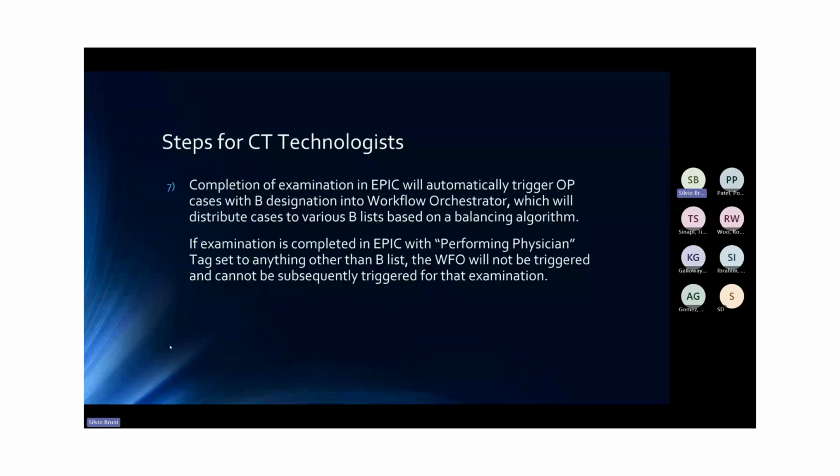Notably, if a case has been completed in Epic with a performing physician tag anything other than B, including if no performing physician was set, just a null tag, the WFO cannot be triggered. It will not trigger. And once that case is ended, there's no subsequent way to trigger that case into the WFO. So please take care and attention to setting that performing physician correctly initially.